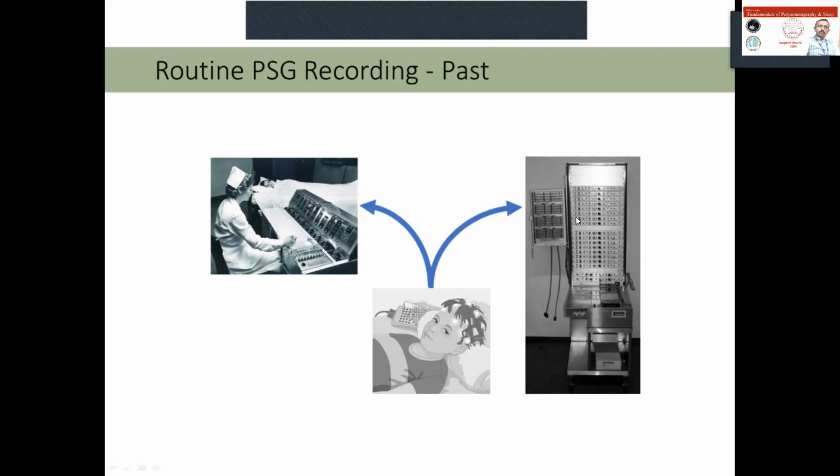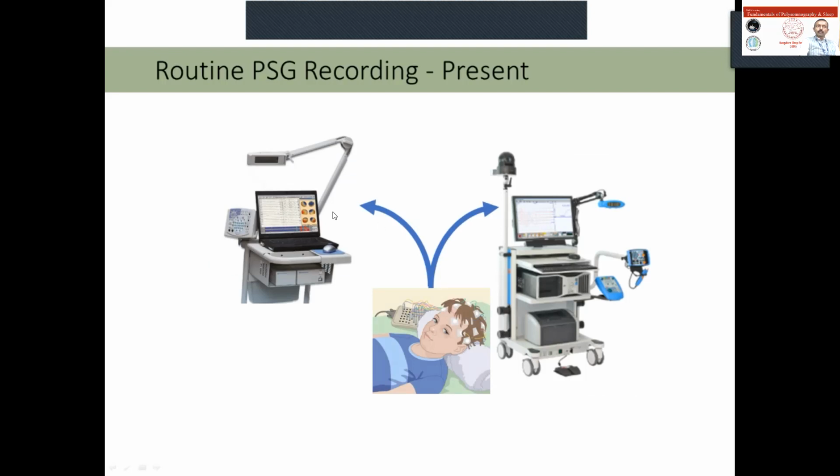But now things have changed at the recording end. Now we have laptops and desktops which can record any number of sensors, and the amplifier is pretty small now. But at the recording site in the clinic, it still remains almost the same. We could even use the old recordings for many of these devices. There have been improvements now.